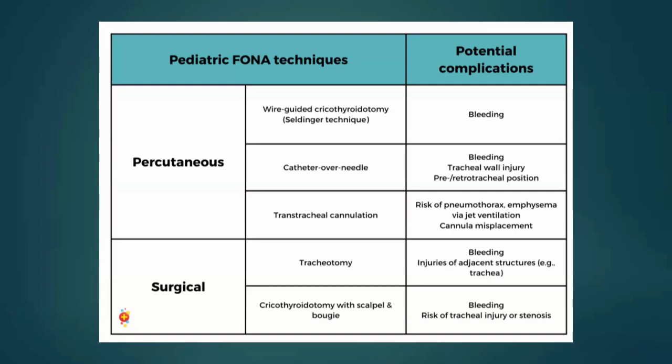A lot of this, you're also going to need to use jet ventilation for these patients, because it is a very, very fine thing. And once again, you either need to have the specific set available to you that you can actually set your pressures to, or what you can do is take a piece of suction tubing and cut essentially a small hole in the top, almost like on a flute or a recorder, and you can use that to breathe. So 1, 2, 3, open, 1, 2, 3, open. Very similar to a neopuff, and then you set your flow at the wall to decide that. Or there's another way where you can use a 2 ml syringe, but I'm not going to be speaking about that. I think if you have time in your units, maybe speak to the registrars or the consultants about these things. They're very finicky procedures.